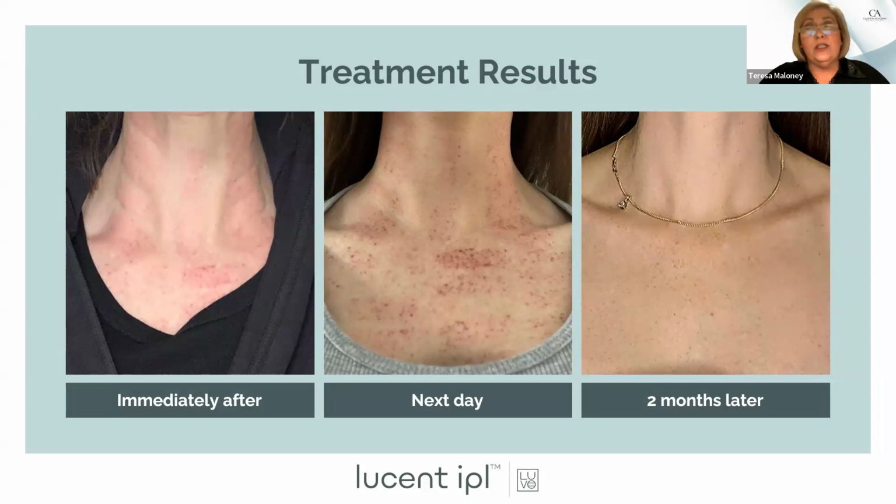One of the things I also recommend, which is something that you guys can do, is take white vinegar and spray it after. If you put down some gauze and make the gauze wet with white vinegar, you very quickly draw out heat that you don't want to be there. If you feel, oh, I think I was a little over aggressive here, white vinegar definitely helps bring out heat.